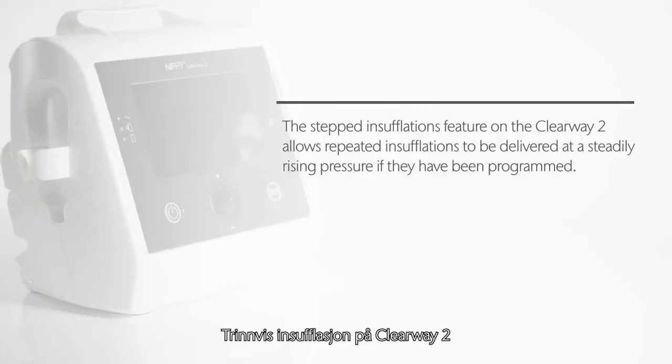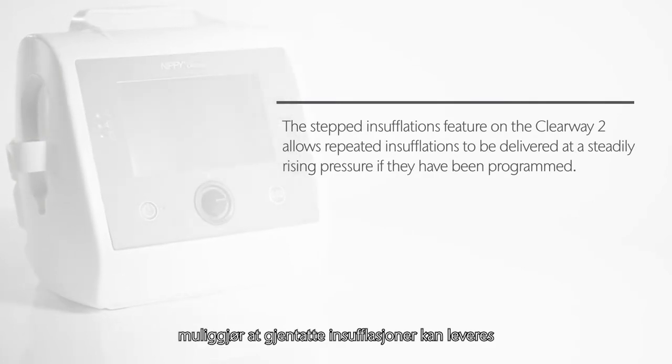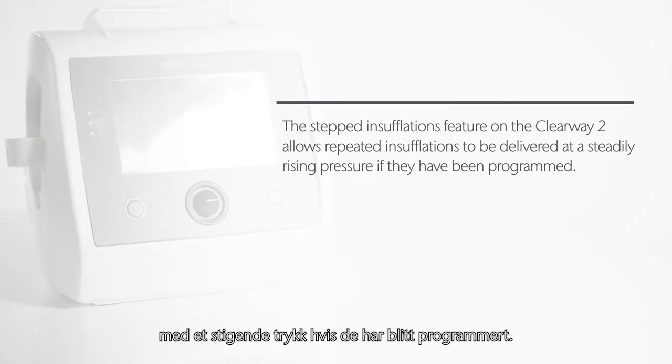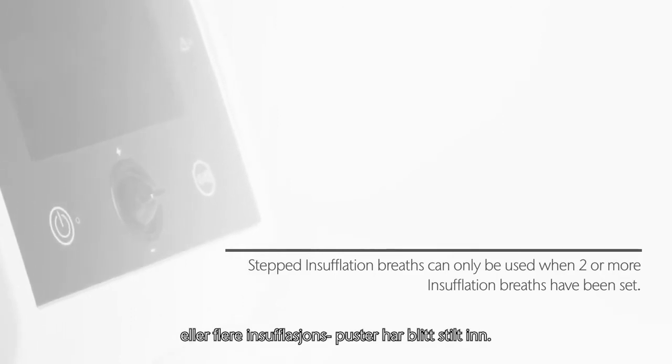The stepped insufflations feature on the Clearway 2 allows repeated insufflations to be delivered at a steadily rising pressure if they have been programmed. Stepped insufflation breaths can only be used when two or more insufflation breaths have been set.